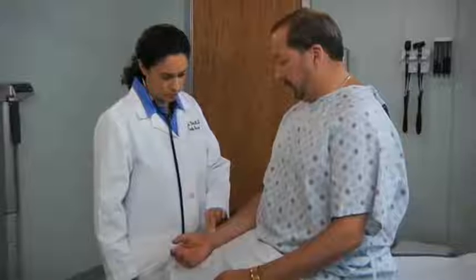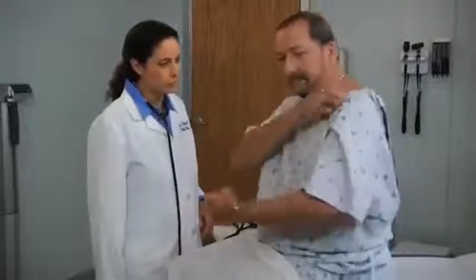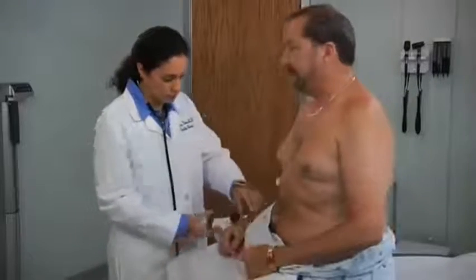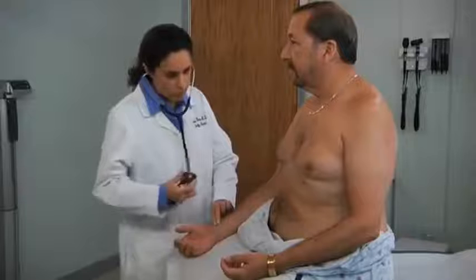To begin your assessment of rhythm, feel the radial pulse. If there are any irregularities, check the rhythm again by listening with your stethoscope at the cardiac apex. Premature beats may not be detected peripherally, and the heart rate can be seriously underestimated. Is the rhythm regular or irregular?